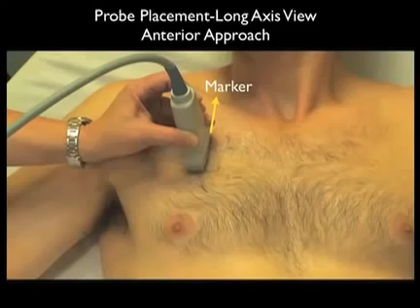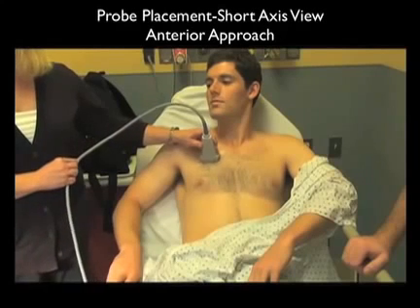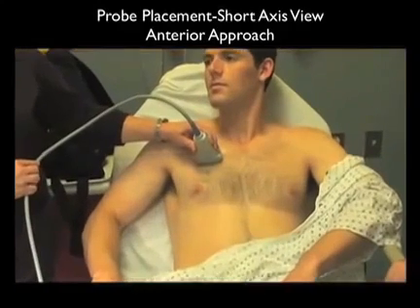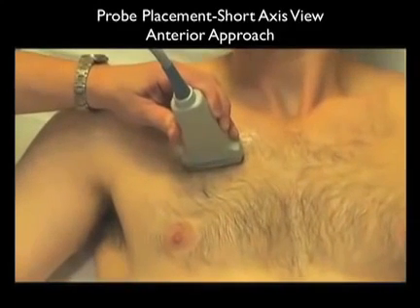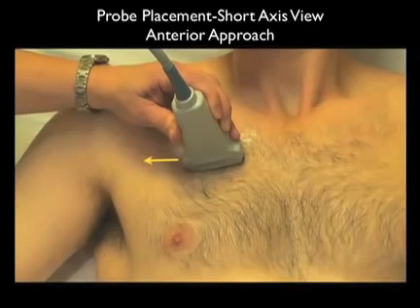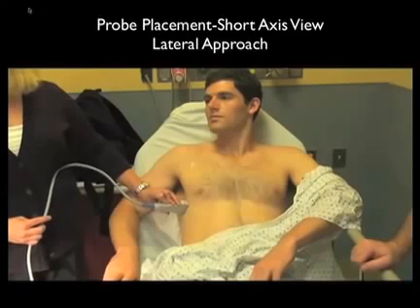Note we're looking in a long axis configuration between the ribs with a marker dot oriented superiorly towards the patient's head. Once we've identified both the ribs and the pleura, we can swivel the probe into the short axis configuration to further look at the pleura and to detect pneumothorax. Here we have the probe oriented in a transverse or short axis orientation between the ribs, looking directly down at the pleura. Notice in this case, the marker dot is located towards the lateral aspect of the patient. Using both long and short axis configurations will allow you to detect a pneumothorax with a high degree of accuracy.